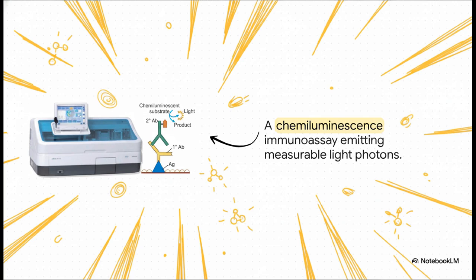Taking it a step further, chemiluminescence uses a luminogenic chemical reaction to emit photons directly. Guys, this makes it 10 times more sensitive than a standard ELISA. Instead of measuring a color change, the enzyme acts on a chemiluminescent substrate, like luminol, producing actual light that gets captured by a highly sensitive luminometer. And because there is absolutely no background light emission in biological samples, your signal-to-noise ratio is completely pristine.